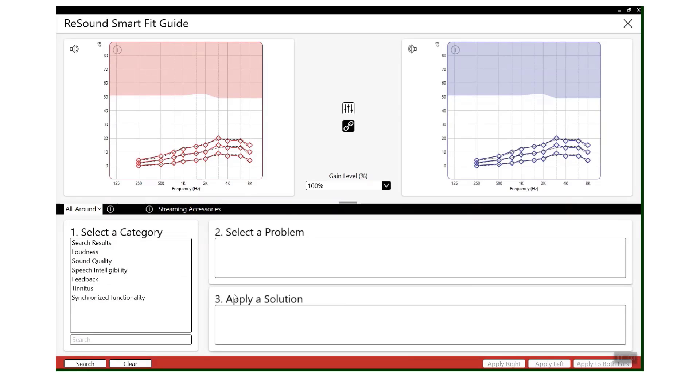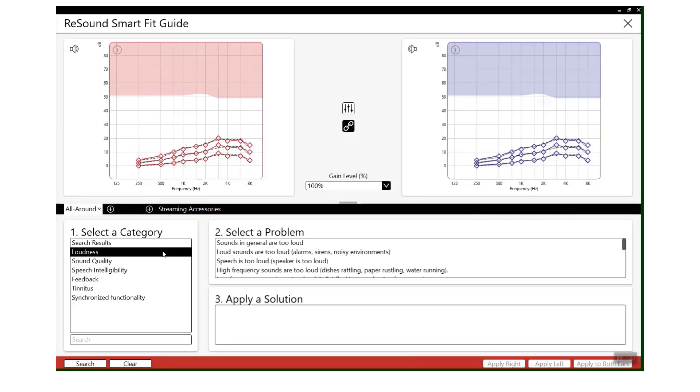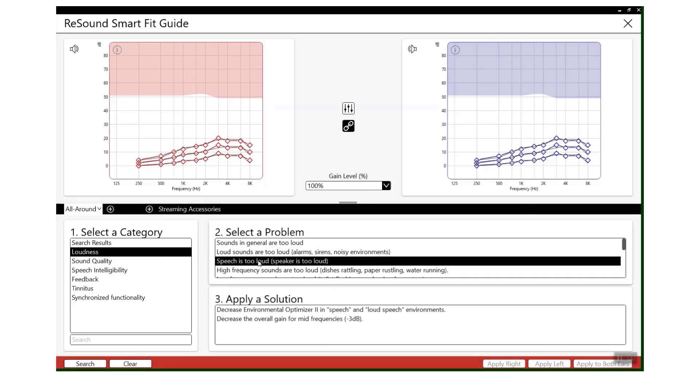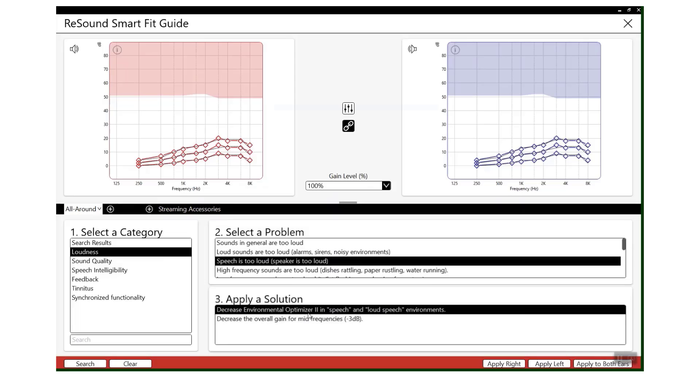For example, Loudness - if you've got a patient that's sat in front of you saying that maybe speech is too loud, this will then give you certain solutions that you can pick and apply to both ears, and it will make that adjustment for you without you having to go and find the features.